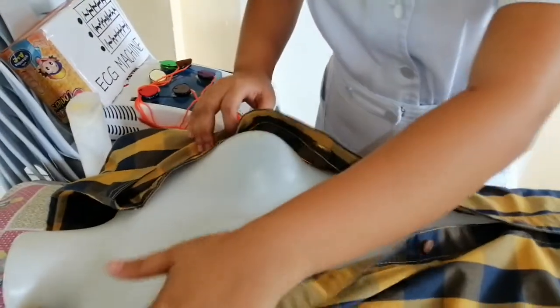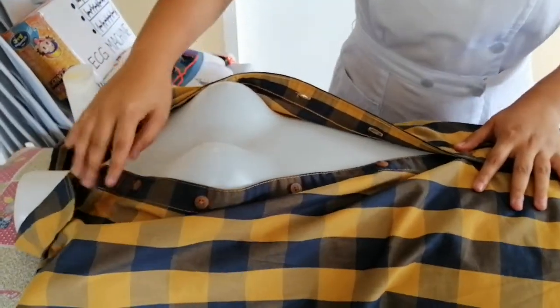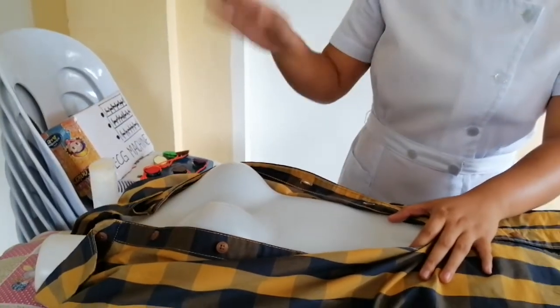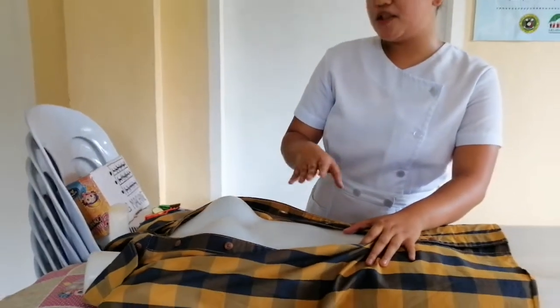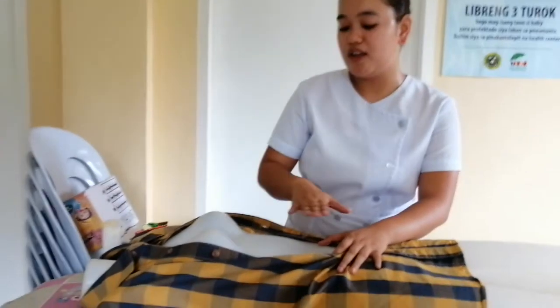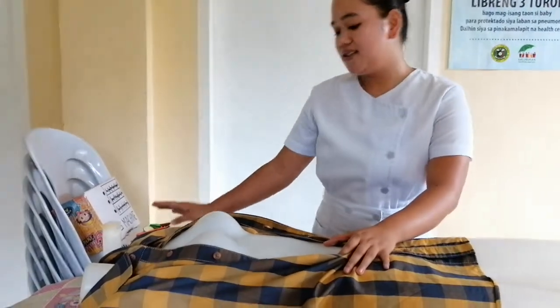Why are we going to assess the chest of the client? It is because we need to take note of problems, such as excessive hair growth that may interfere with the placement of the leads on the chest.